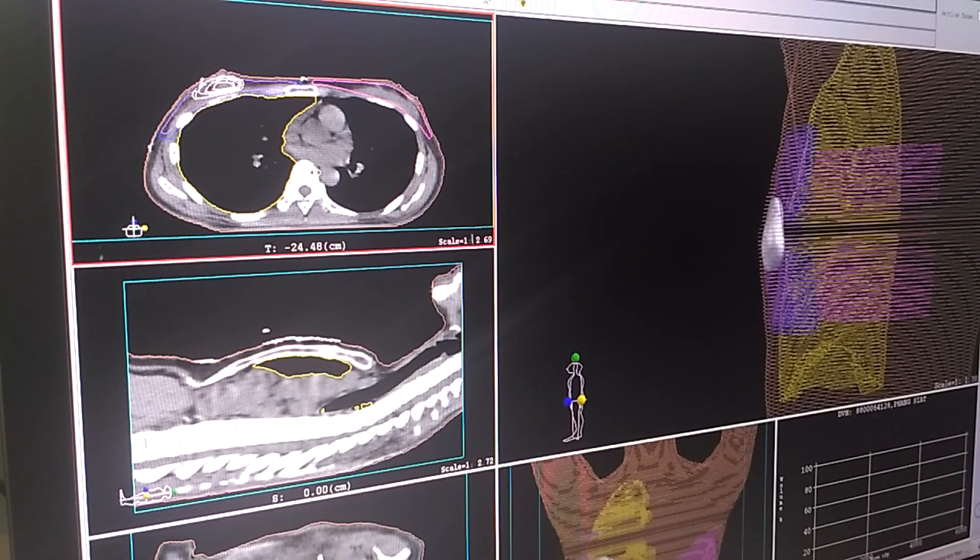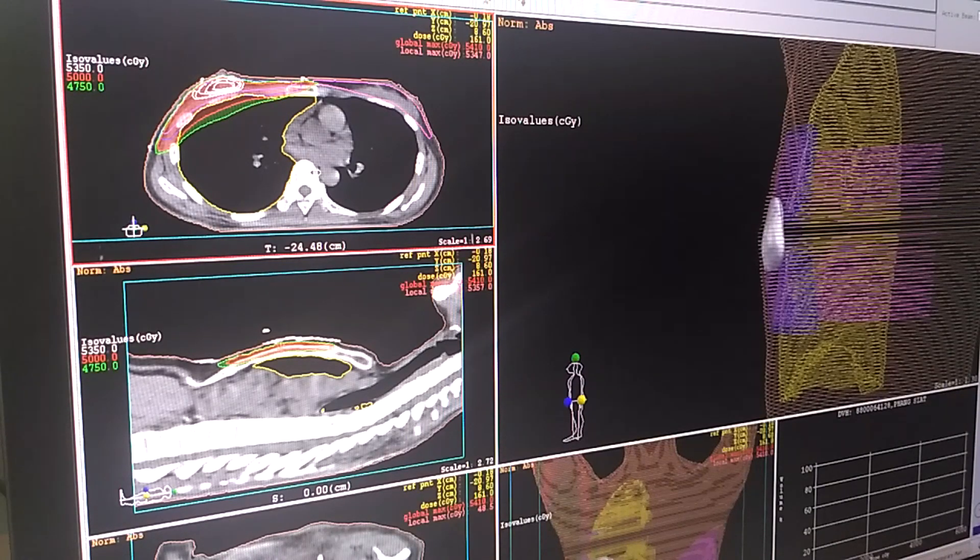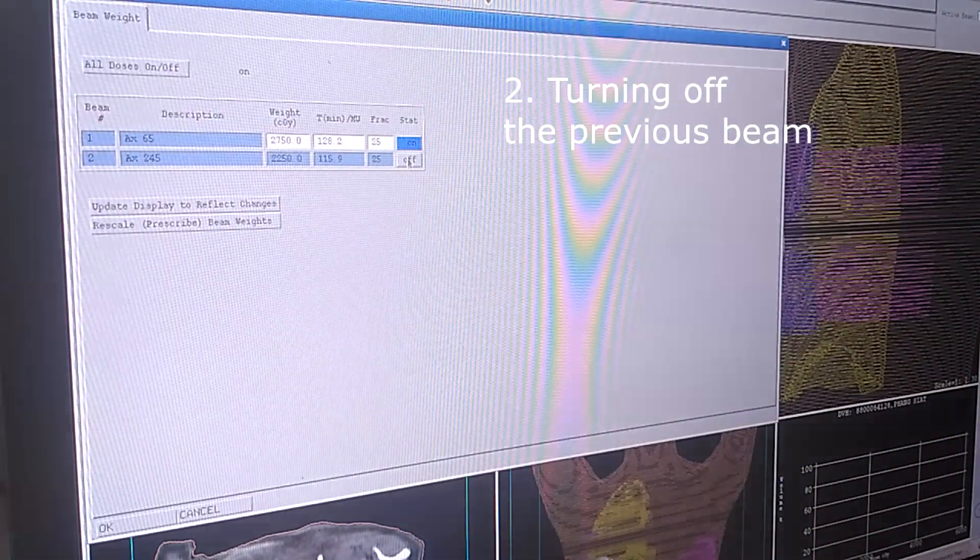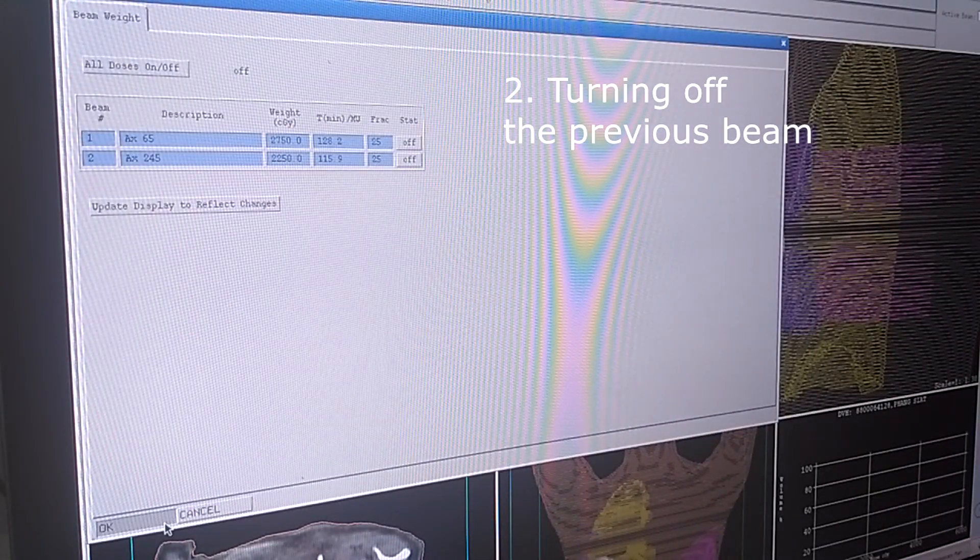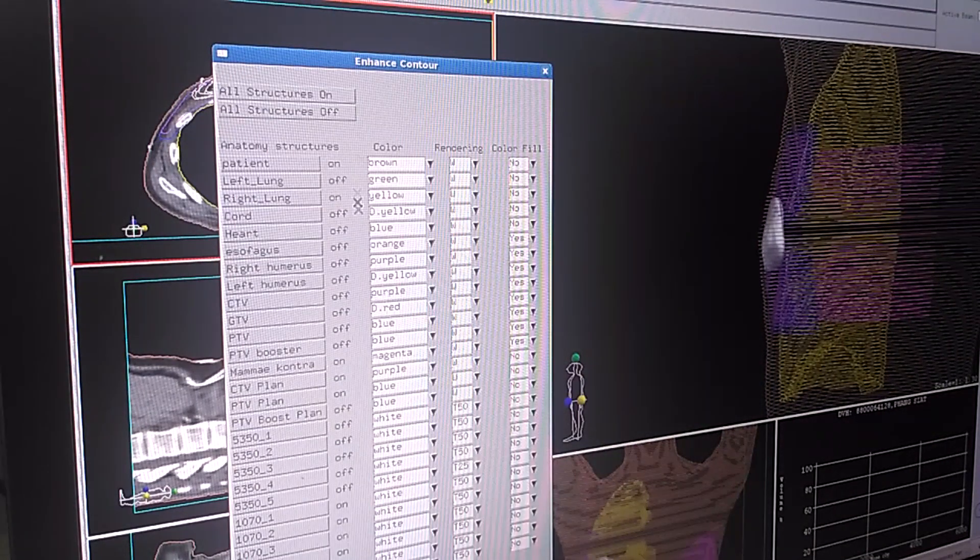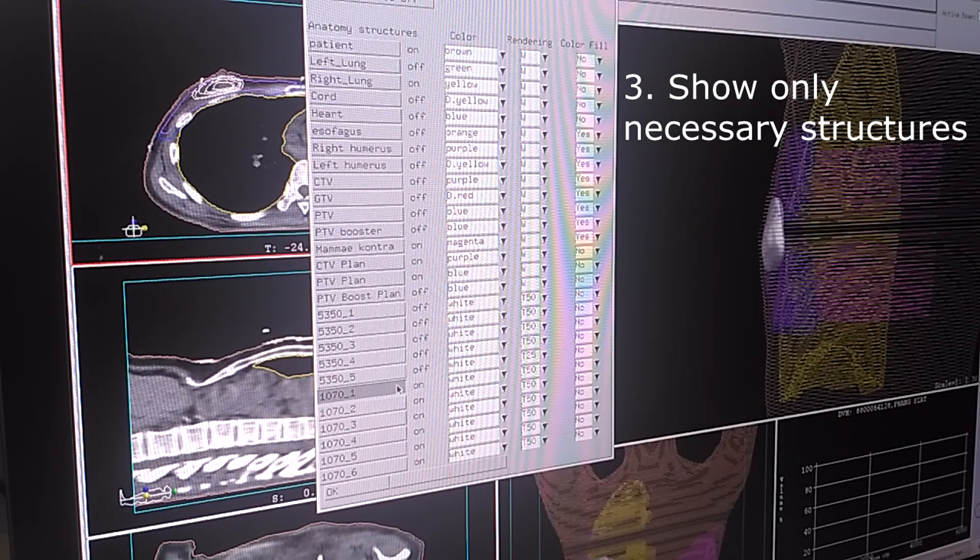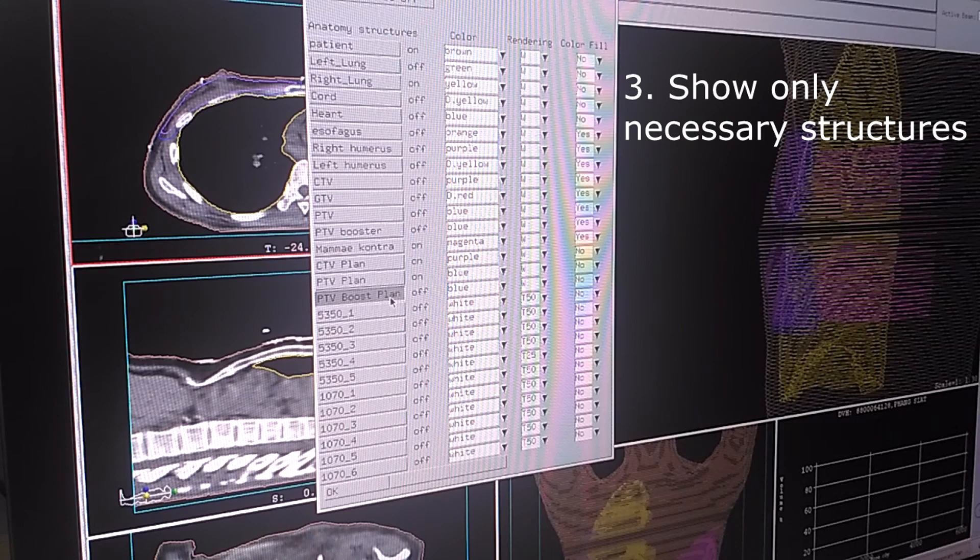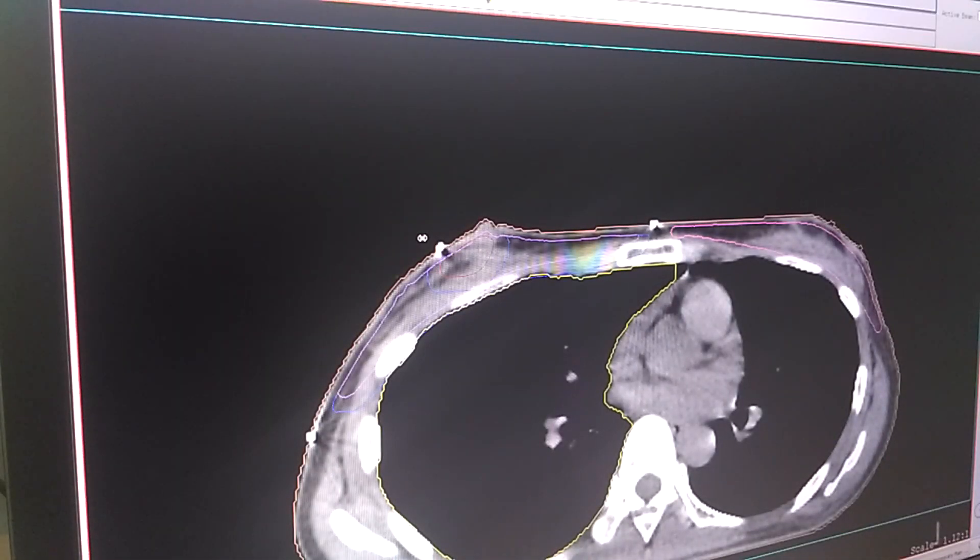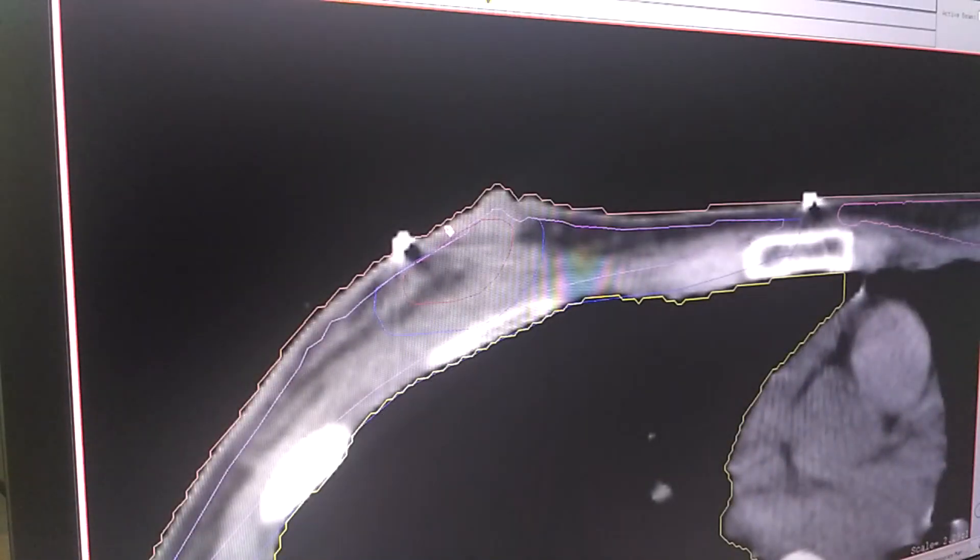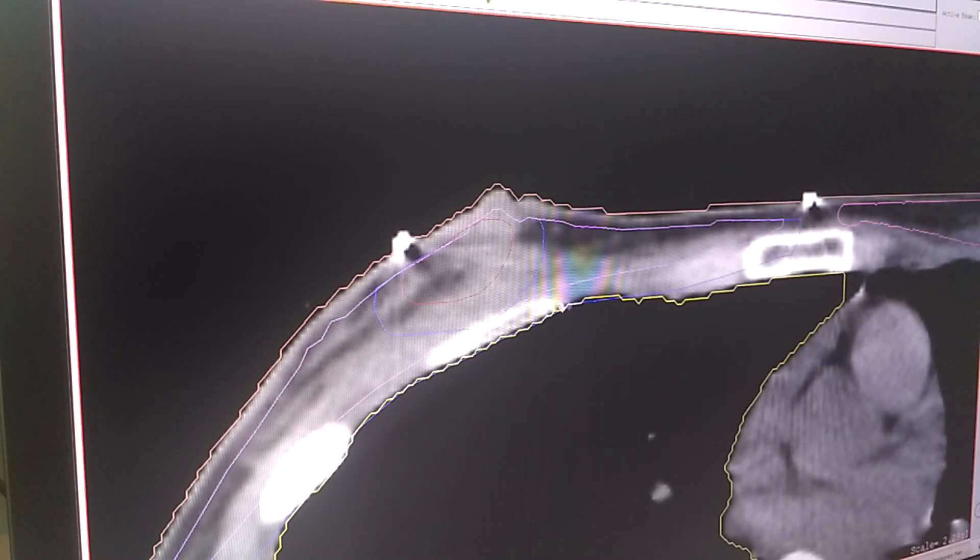Here we have a local breast case. The first thing I'm going to do is turn off the previous beam from the previous planning and then I'm going to show only the necessary structures. Here I'm going to maximize it so you can see better. This is the booster area and this is the previous PTV area.